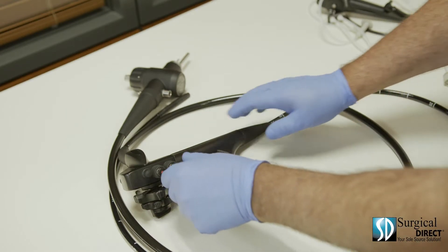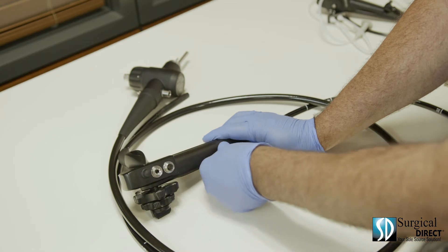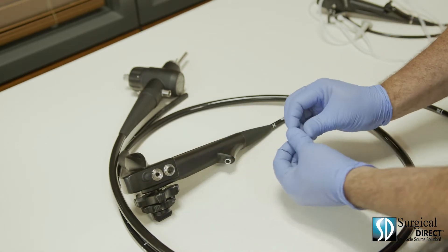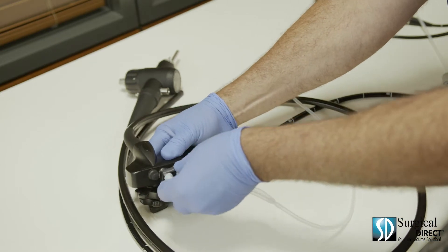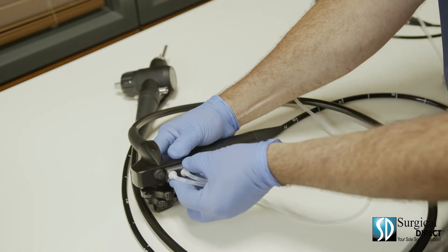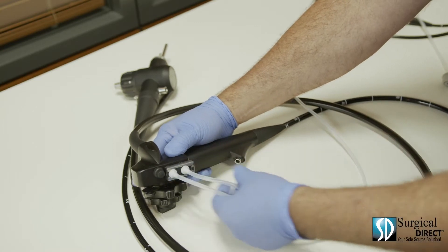Each scope comes with a cleaning adapter. Simply remove the air, water, and suction valves along with the biopsy port cap. With the small end up, attach the cleaning tubing to the control body of the scope. Make sure it's locked on.